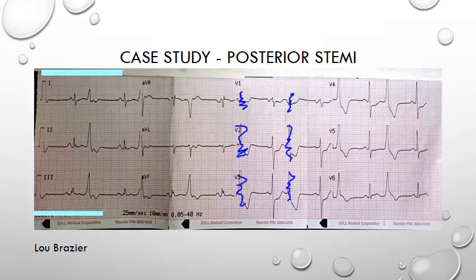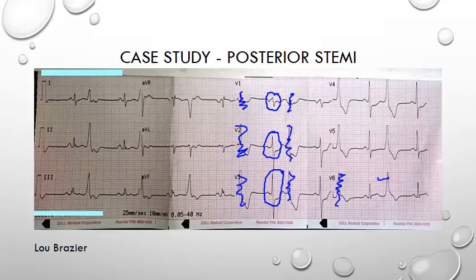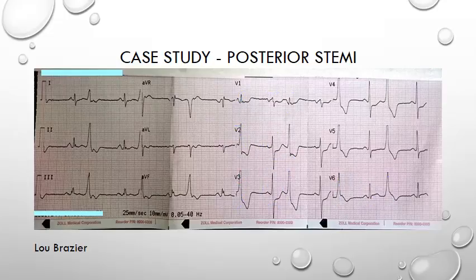In the normally conducted complexes there is ST depression with tall R waves: V1 has ST depression, V2 has ST depression with a tall R wave, and V3 has ST depression with a tall R wave. This ECG is highly suspicious of a posterior STEMI, and that suspicion is supported by V6 also being slightly elevated. Lou did perform a posterior ECG using three leads and reported a small amount of ST elevation in V7 to V9. Given the history together with this ECG, posterior STEMI is highly likely.